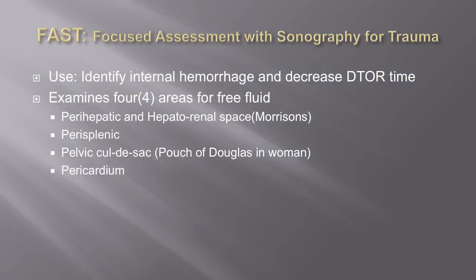So what else do we use it for? Well, for those of you who are gonna work at a trauma center, it is now required. We're talking about an ultrasound requirement. It is required for you to do a FAST exam on the patient. FAST stands for Focused Assessment with Sonography for Trauma.